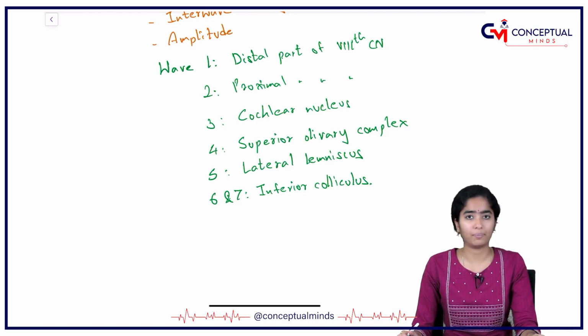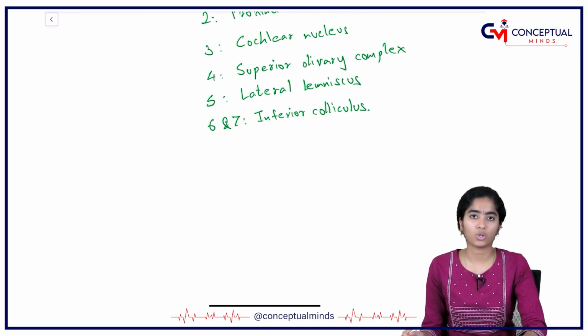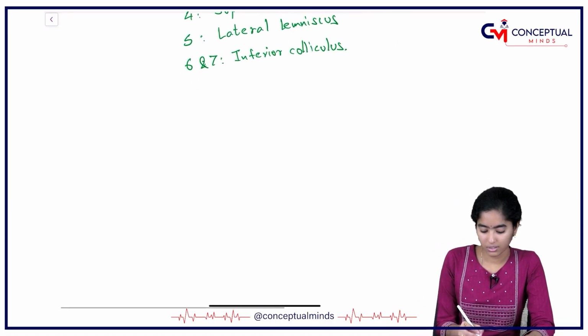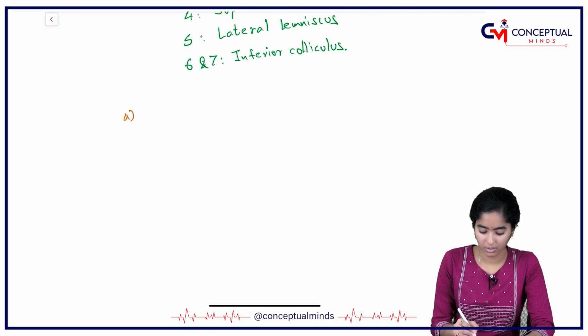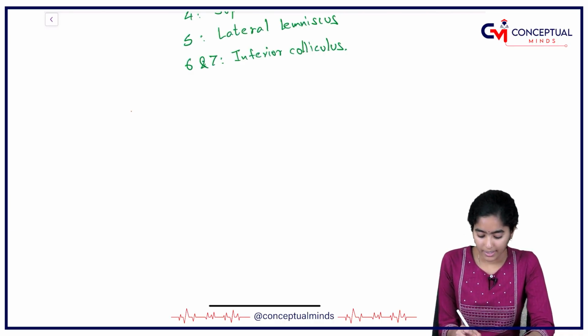And the uses of ABR are, because this is also an objective test, we do not need the cooperation of the patient or any response from the patient. This test can ideally be performed in infants and children.